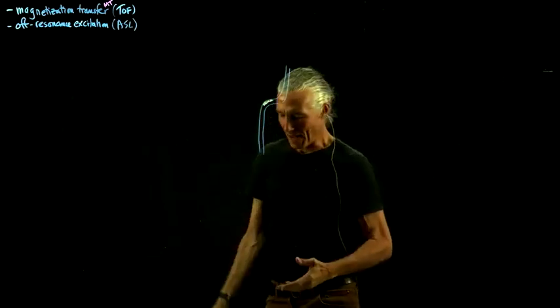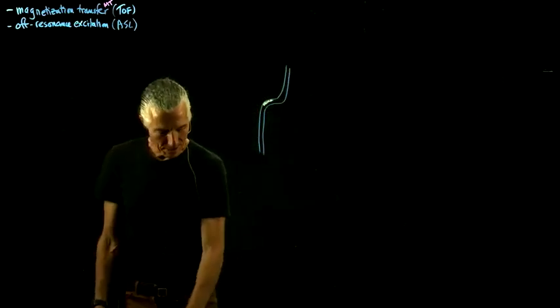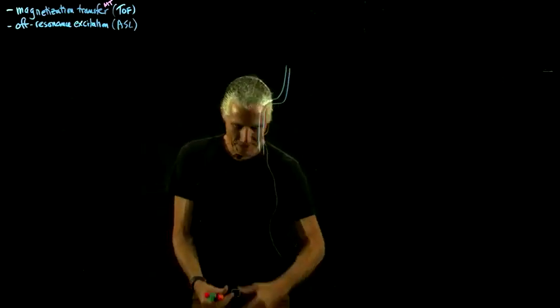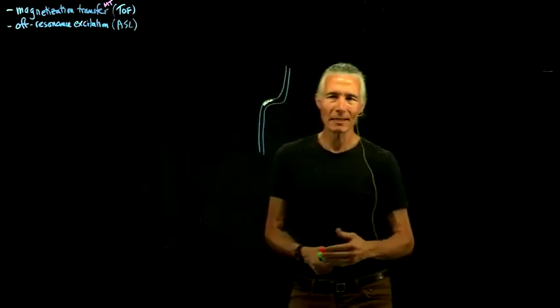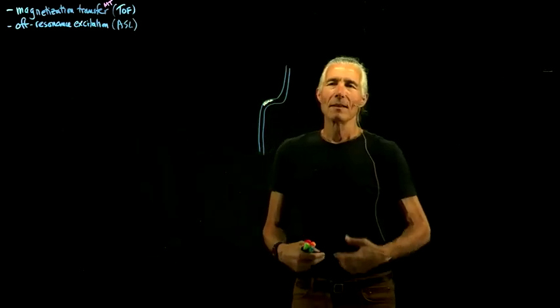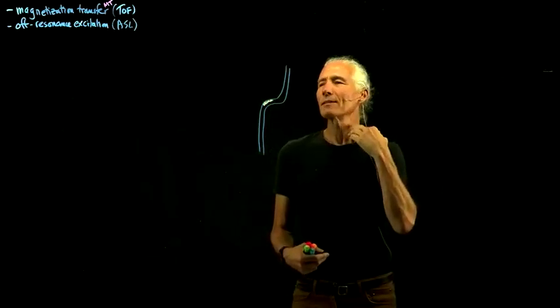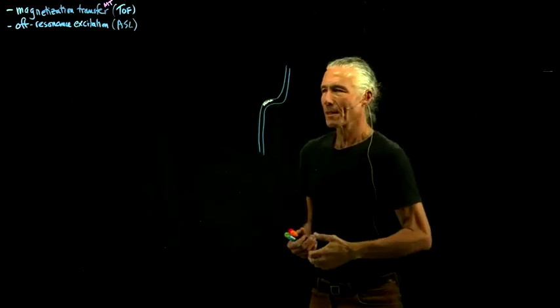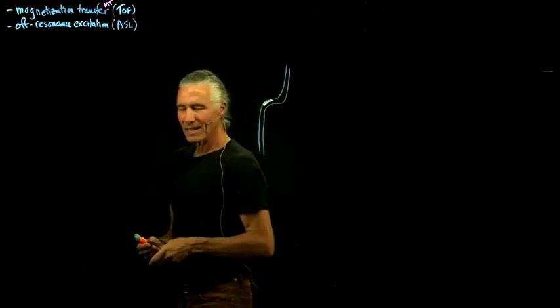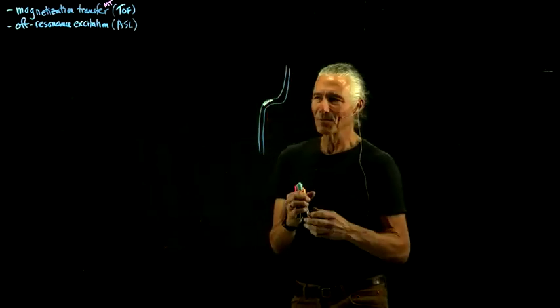So, how do you visualize the blood vessels? Well, it turns out there's an easy way to do it, which relies on the fact that if you're imaging something like the brain or some blood vessels in your neck, the spins in there are moving. And this is a very strange thing to think about, just physically. How does this actually work?